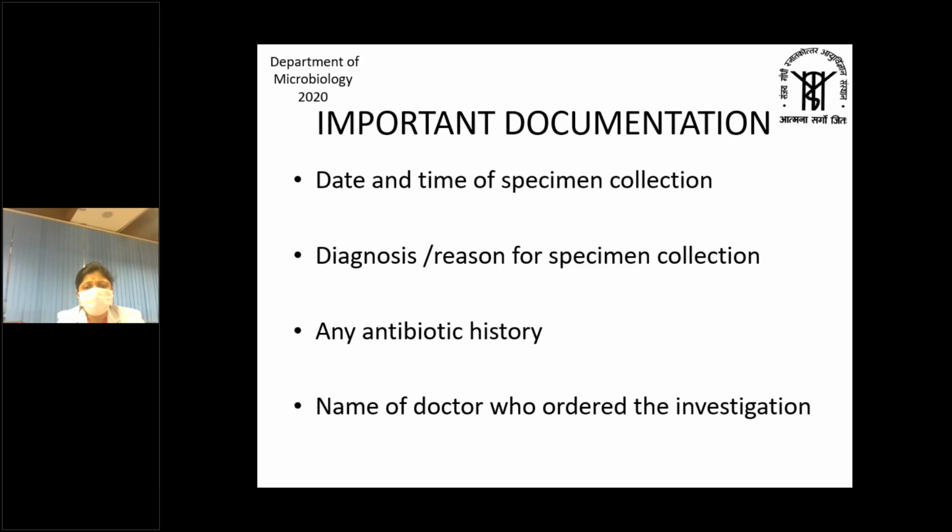Apart from this, what are the other important documentation that have to be present on the form? The date and time of specimen collection preferably, the diagnosis and reason for specimen collection, any antibiotic history, and of course the other details regarding the raising of the form, from which ward, the person who ordered the investigation, etc.